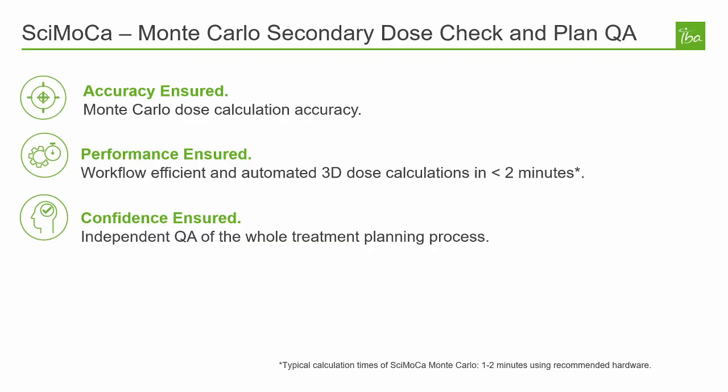SciMoCa is a Monte Carlo dose calculation engine that uses machine-specific beam models to provide powerful analysis and reporting in a streamlined, web-based interface that runs on your local server infrastructure. The system is designed to run automatically and without the need for proprietary hardware. The end result is a plan QA tool that is one of the most reliable and most robust solutions in the market.